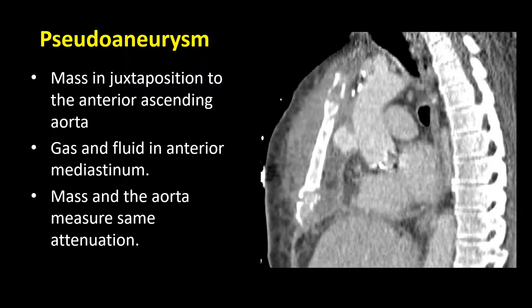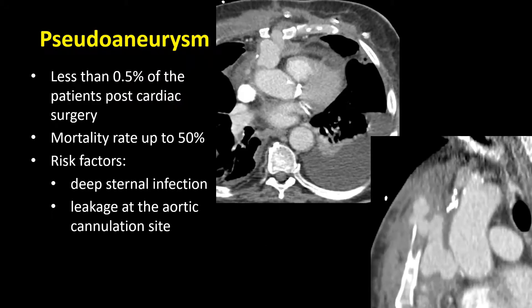Here is another image of the same pseudoaneurysm in sagittal reconstruction. If you're unclear on the transaxials, reconstructions can be extremely helpful. We see this very narrow neck with a large outpouching, unlike the chimney remnant which is well demarcated and very focal. This is a very typical appearance of a pseudoaneurysm. In this patient, because of the associated gas, fluid, and sternal dehiscence with underlying infection, the decision was made to try to treat the patient with antibiotics before proceeding to repair.